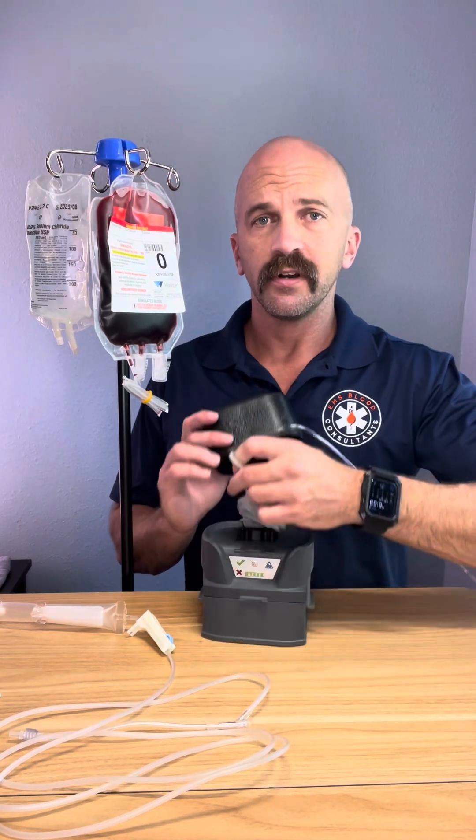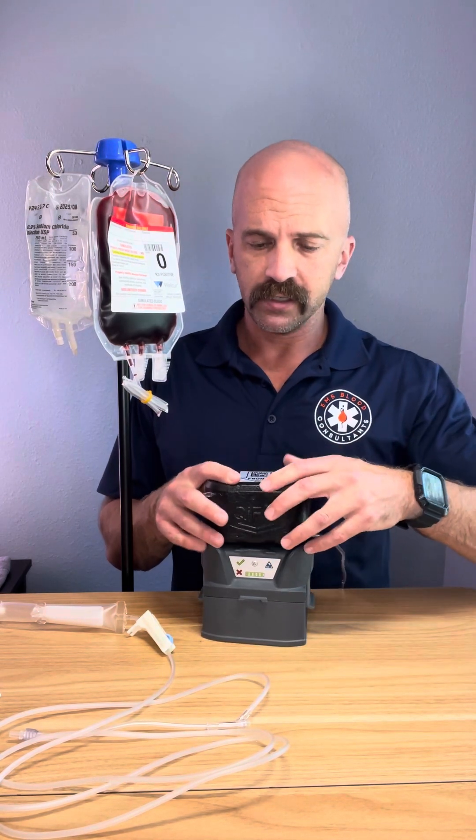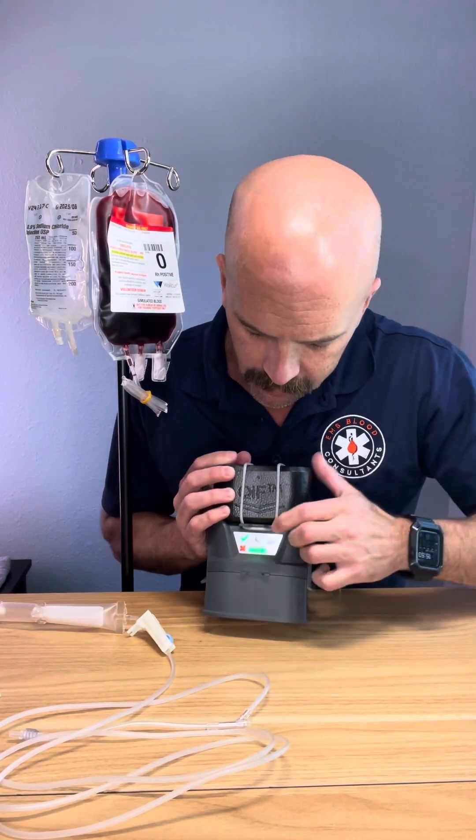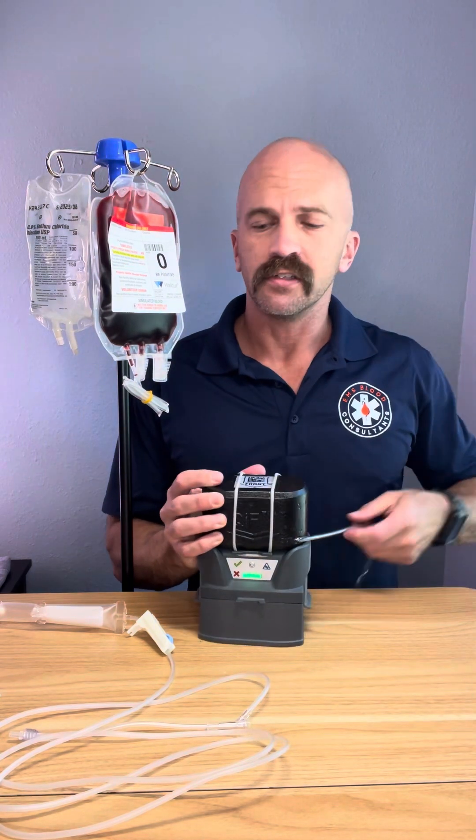Pretty simple setup here. Just plug the block in — there's only one way it can go, we call that firefighter proof. And it automatically turns on; it's already starting to heat up.